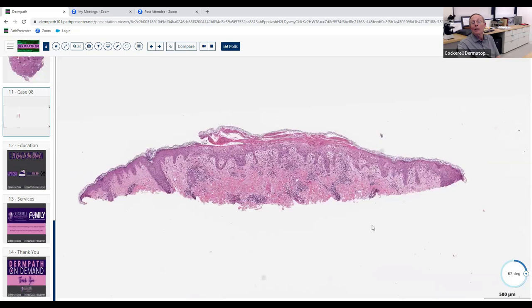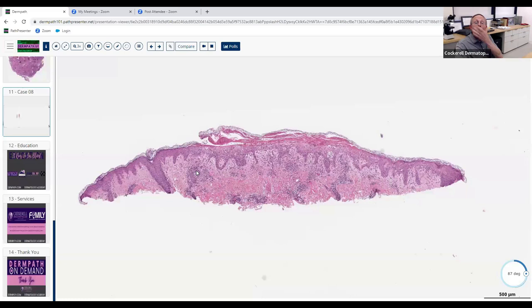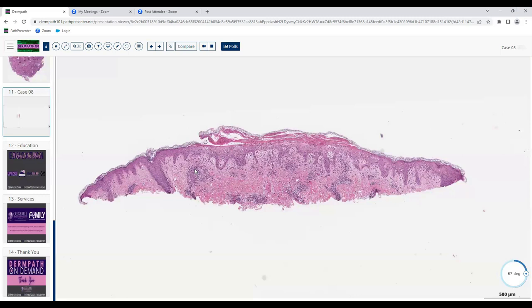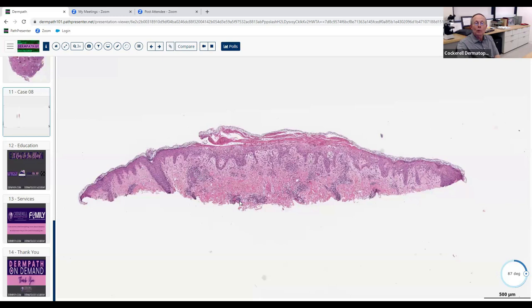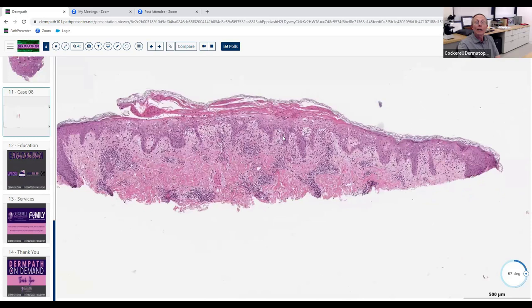Since we have one arm tied behind our back, we'll still try to make a definitive diagnosis. Some things were also abnormal about the epidermis. So what's the pattern in the dermis that we do have? Between perivascular and lichenoid — it's close to the papillary dermis. There's perivascular inflammation going to the mid-reticular dermis — it might go deeper, we don't know — and there's also some interface involvement with lymphocytes.